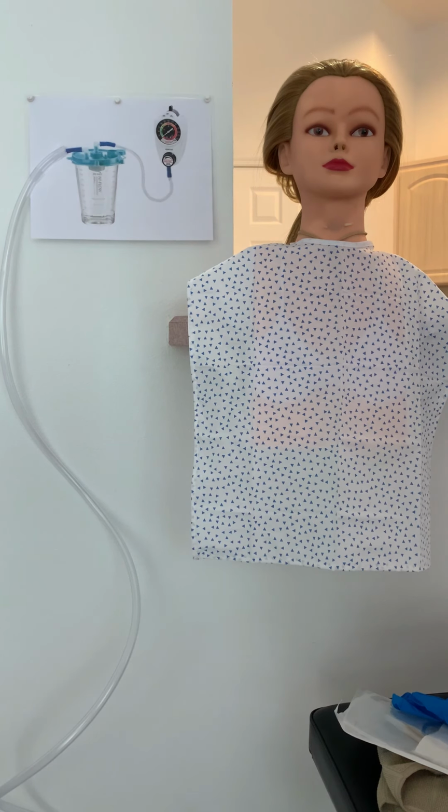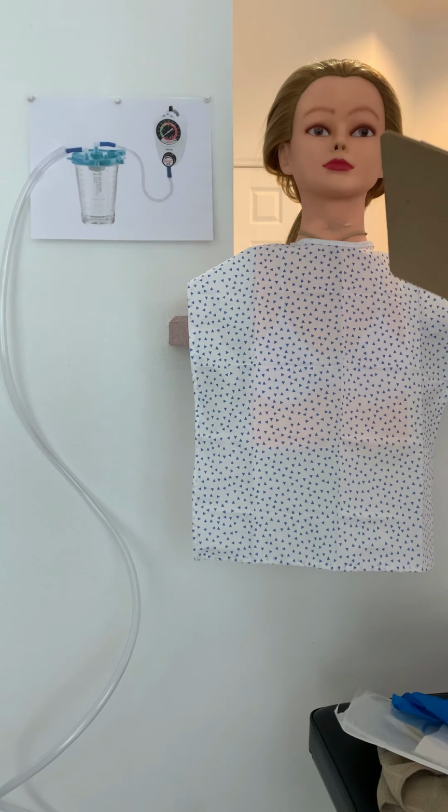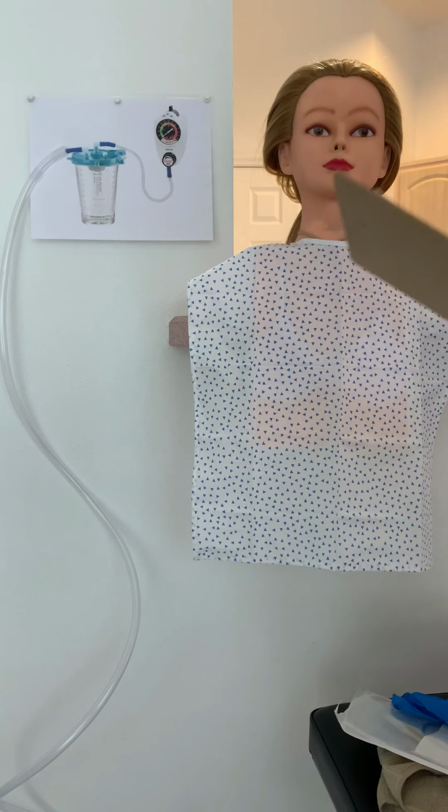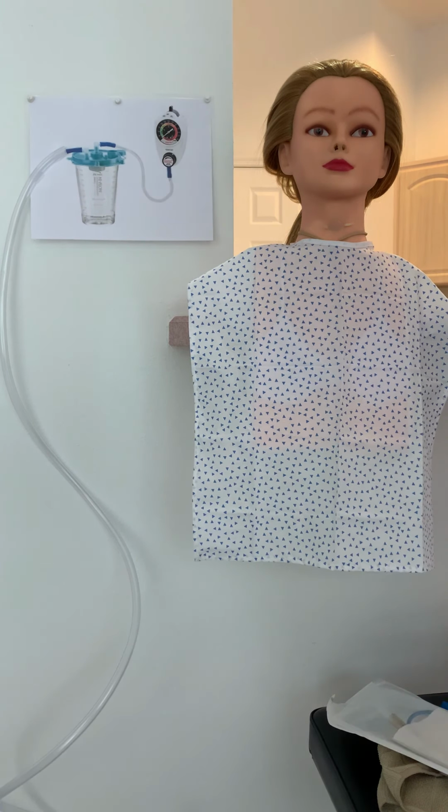All right, today I'm going to demonstrate for you how to place an NG tube. So the first thing we're going to do is review the client's medical record and verify there's an order, and I see that there is. So next we're going to gather our supplies. Once we've got all our supplies gathered, we are ready to go to the patient's room.